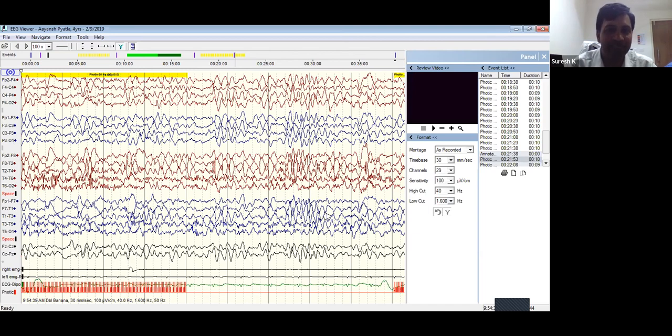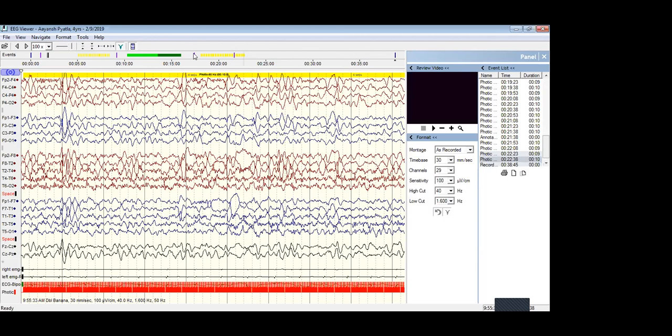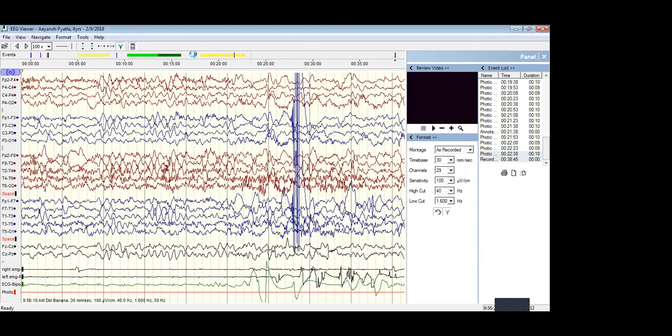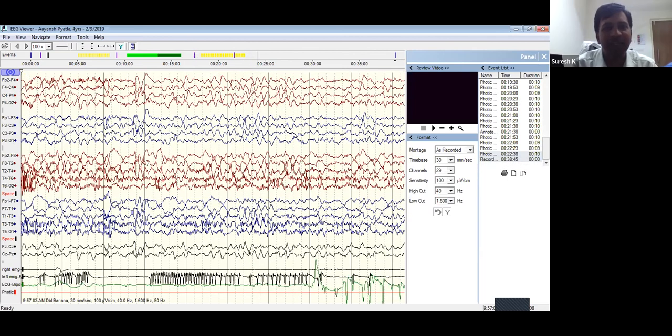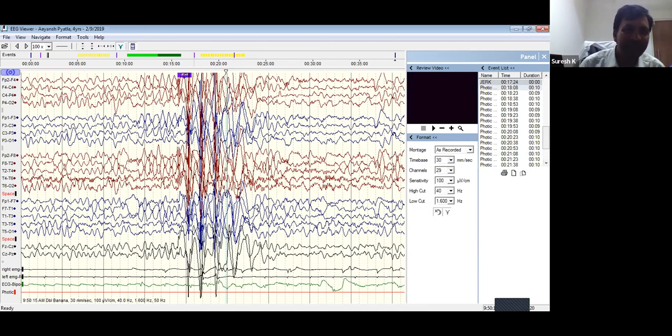Like in this one, at least, if you see the EEG. Astha, you are seeing the EEG here? Yes, sir. So you are finding some abnormality. Yes, sir. Sir, can you describe the video once? Then she can describe. Video is of a 4-year-old child. When he is sitting during the EEG, he had small amplitude jerks of both the shoulders.